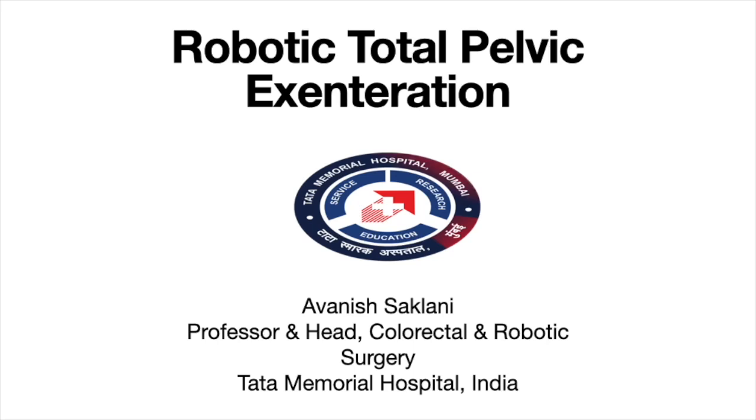This video demonstrates robotic total pelvic exenteration with intracorporeal ileal conduit. We have nothing to declare.